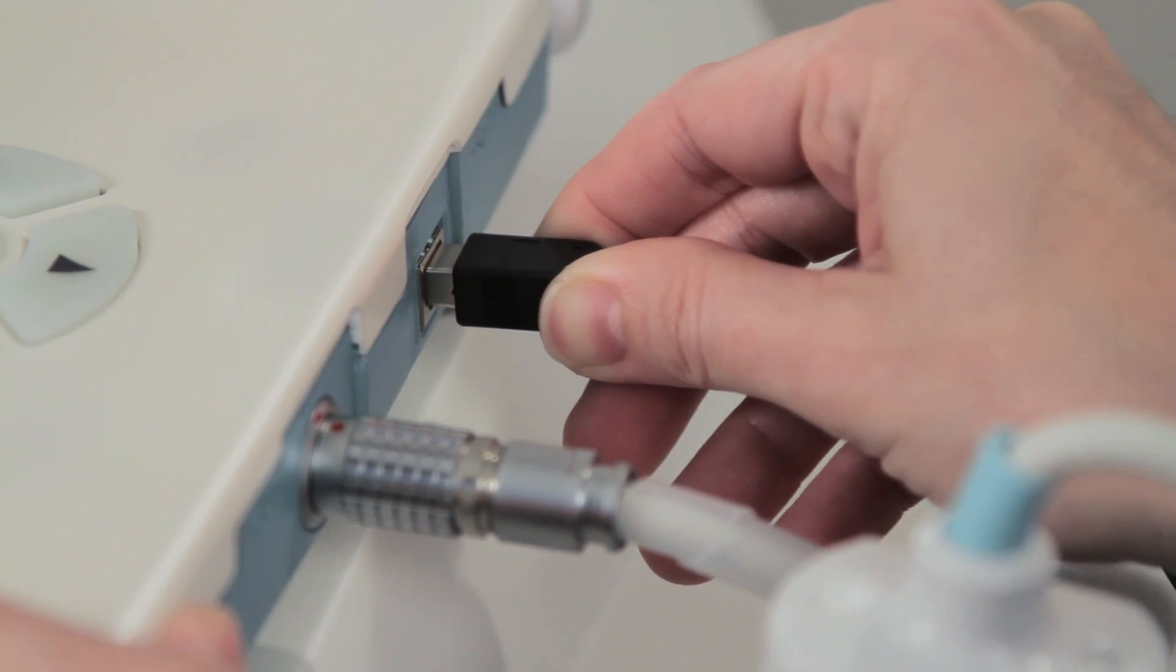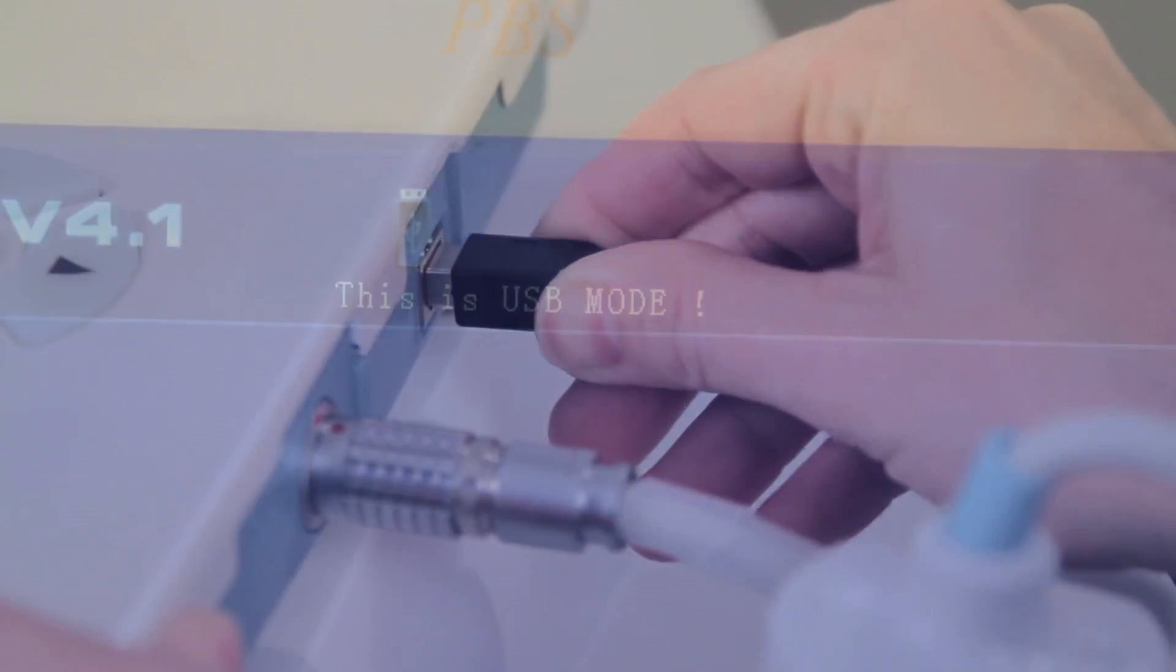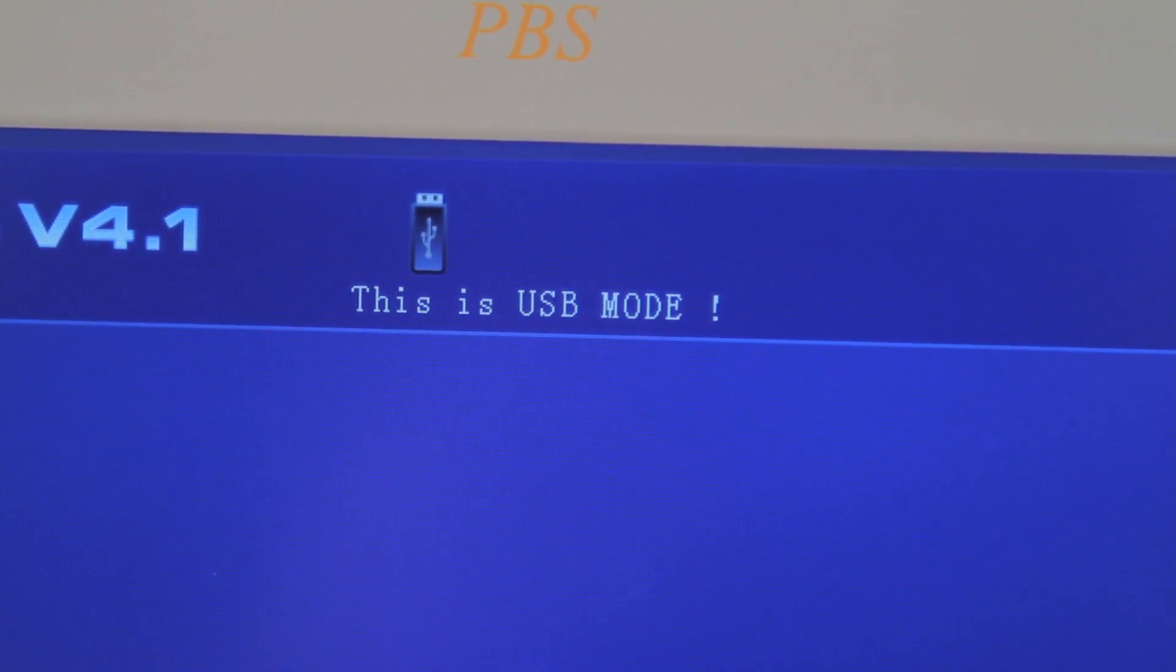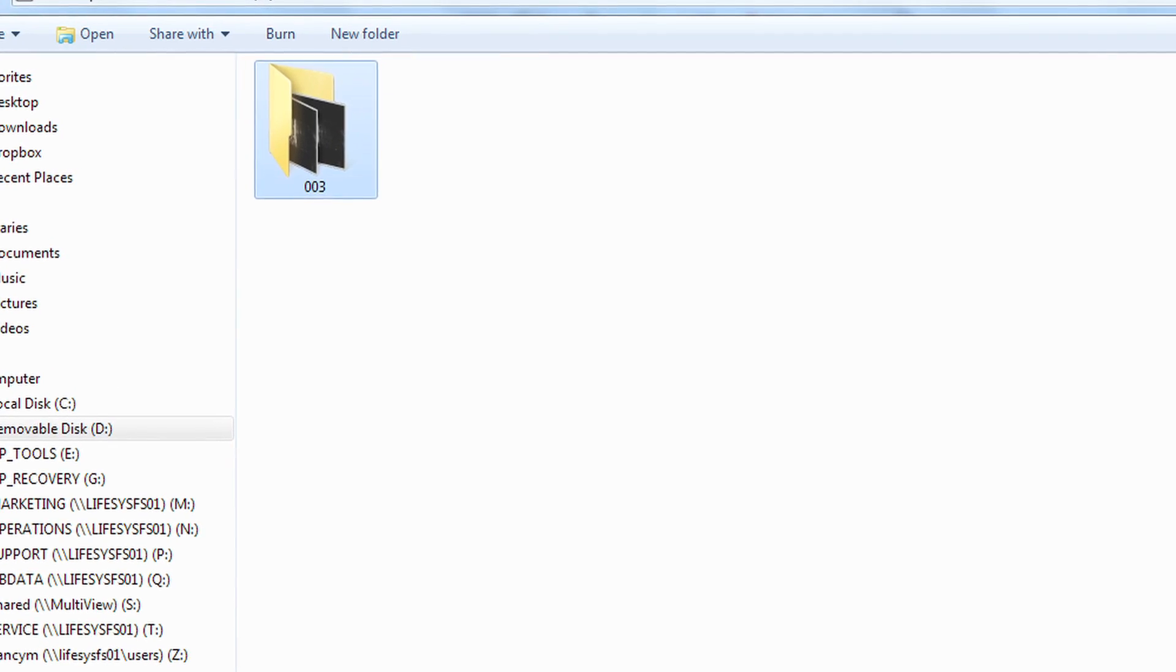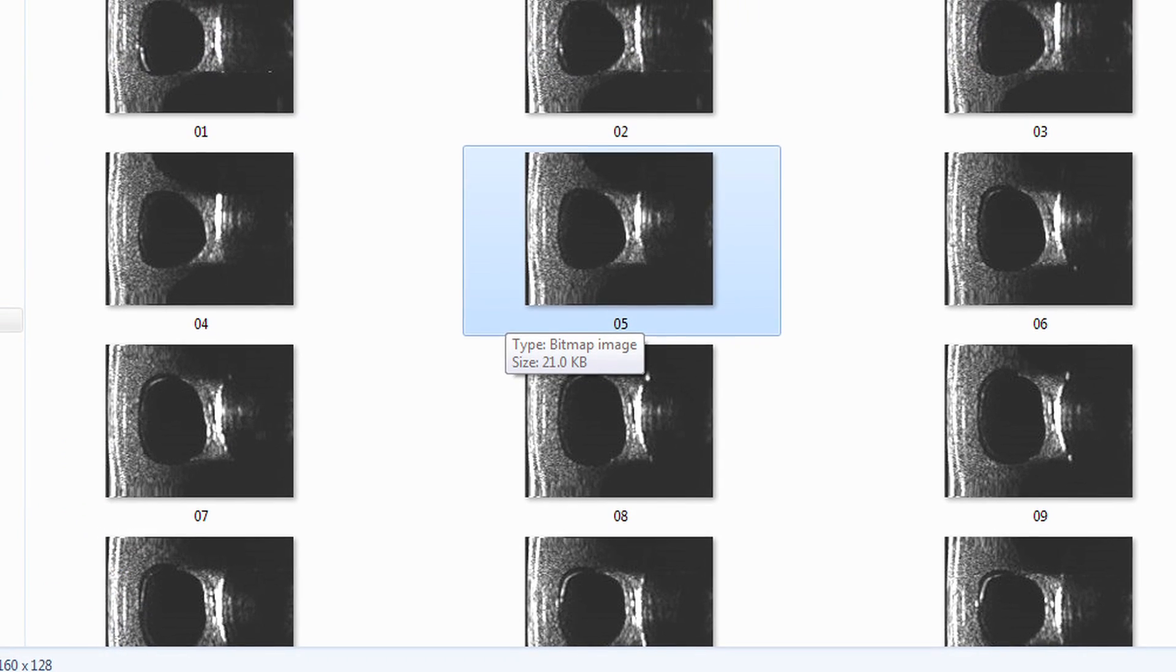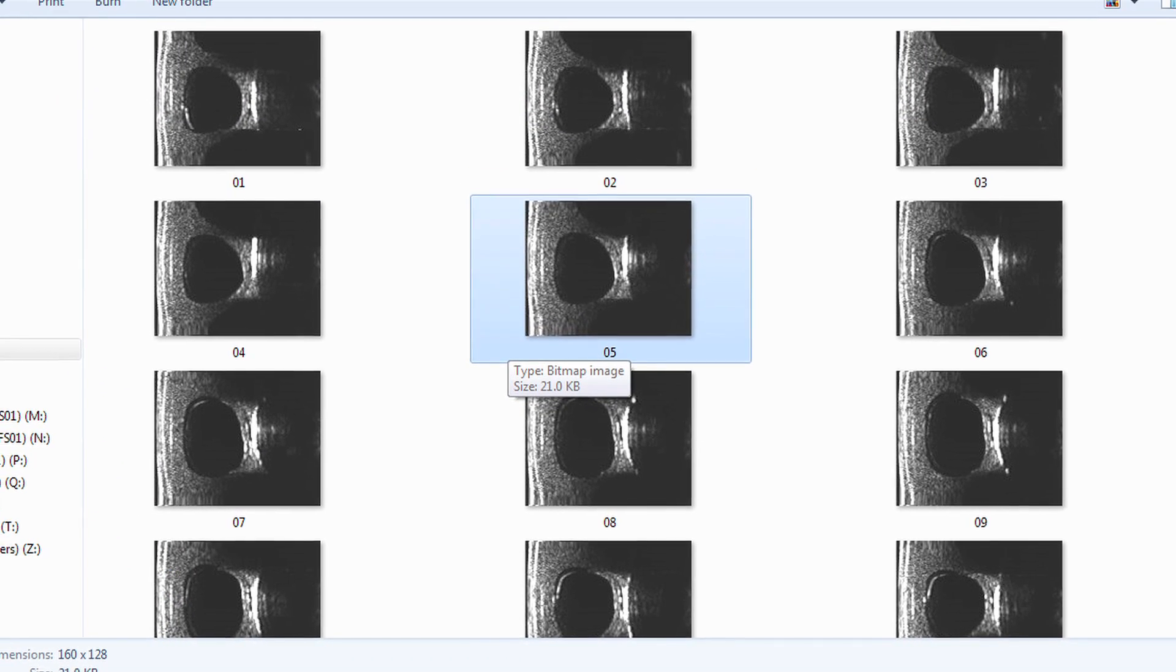You may export the historical data saved in the system to your PC using a USB connection. The system will also build a folder for each user. The info in the folder should correspond with the patient's ID. Only grayscale images and a copy of saved readings will be saved in each folder.